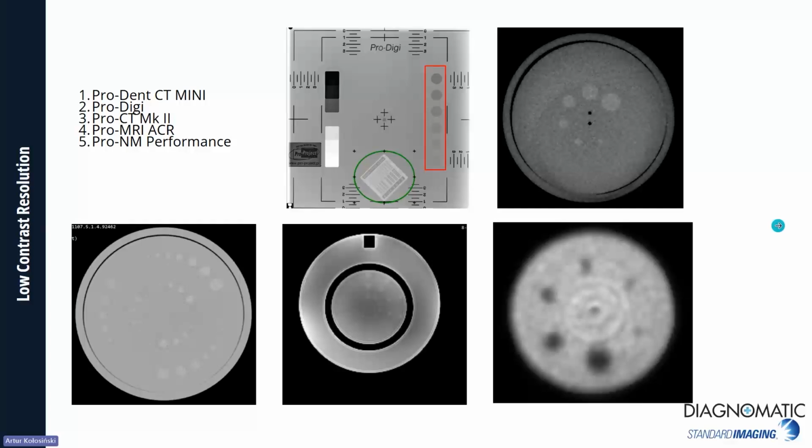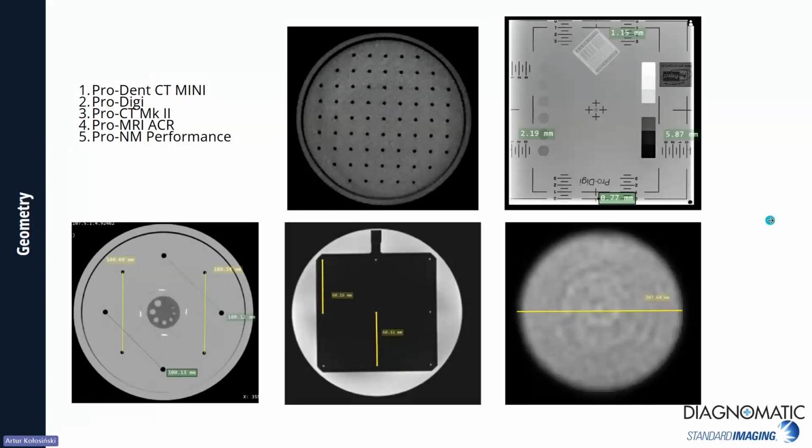In the low contrast, we base on the contrasts. So here we have a few examples for dentistry, X-ray, CT, MRI, and nuclear medicine.